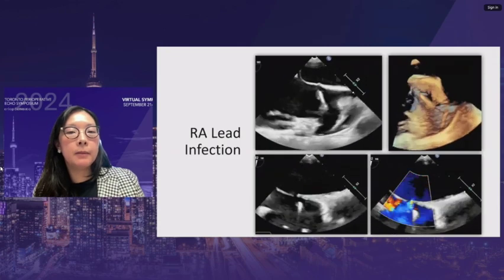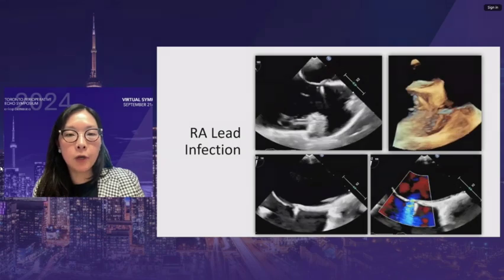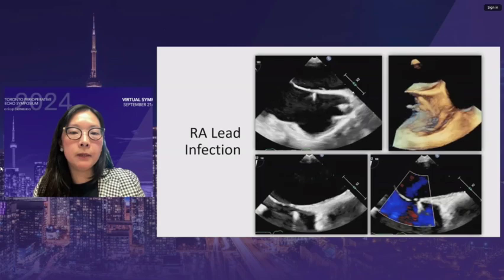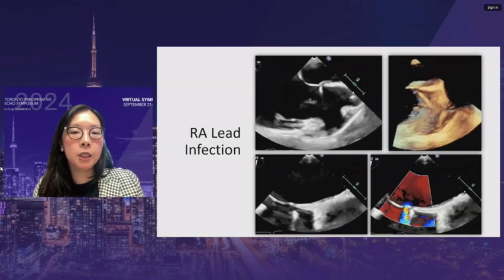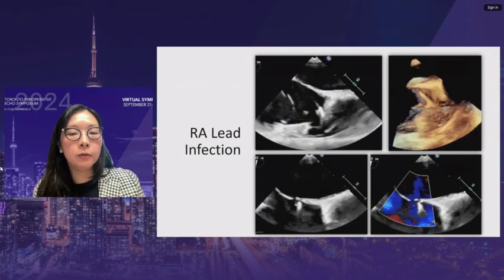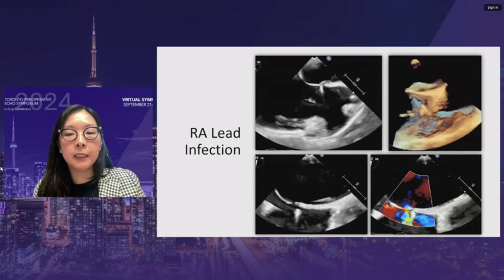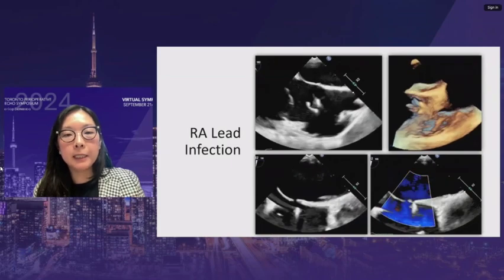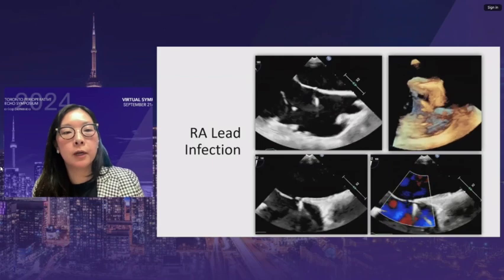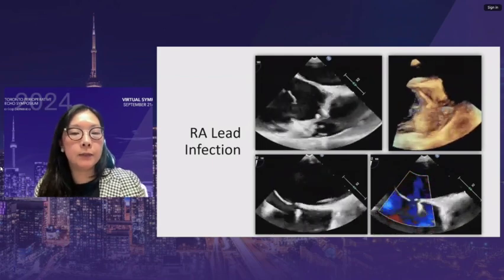Not just prosthetic valves but any intracardiac or intravascular device can become infected. A patient with a pacemaker lead shows the right atrial lead going into the right atrial appendage with a large vegetation on it. Additionally, a small ASD with shunting is present — making this more of an emergency due to concerns of embolization, even though the flow is predominantly left to right.